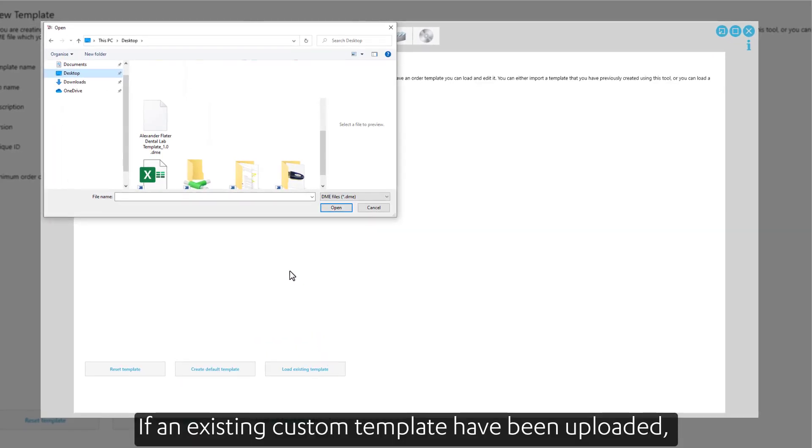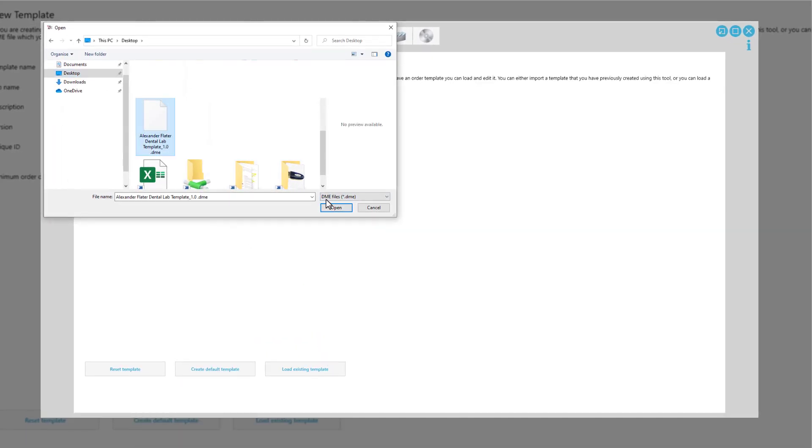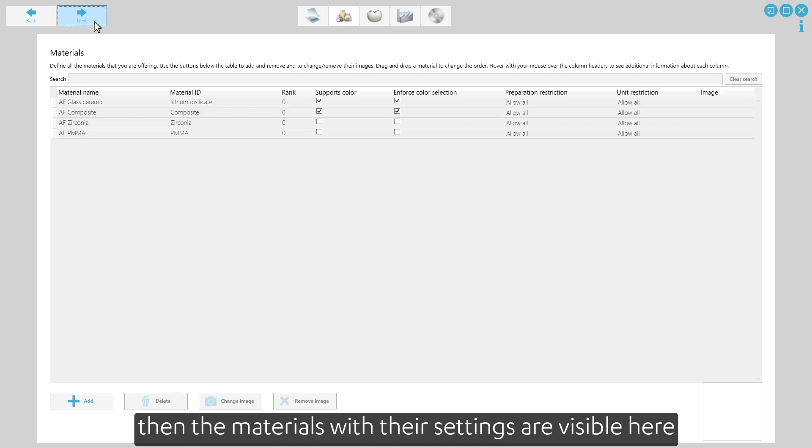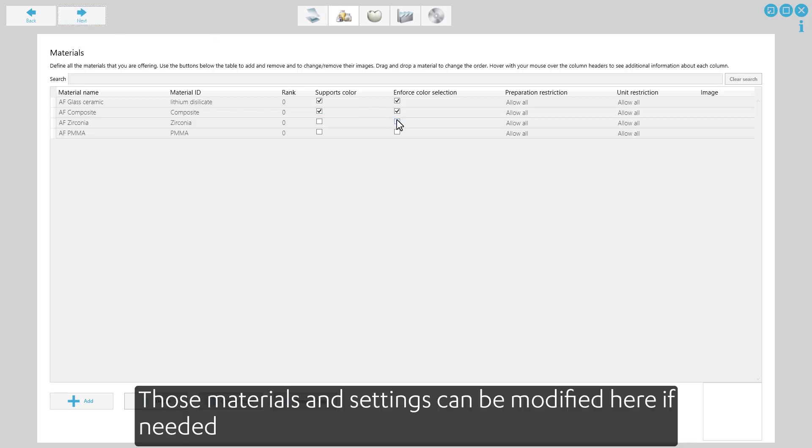If an existing custom template has been uploaded, then the materials with their settings are visible here. Those materials and settings can be modified here if needed.